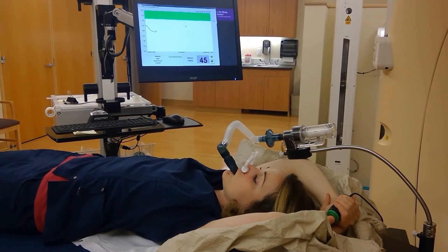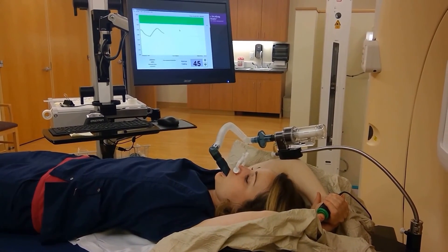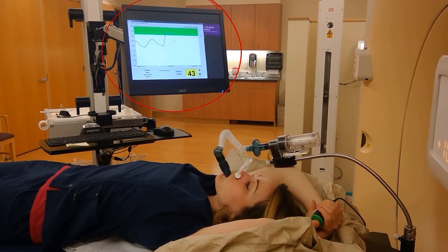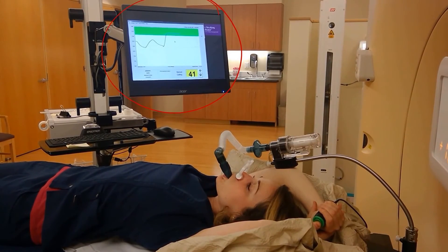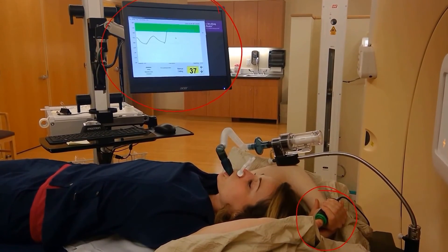This is an example of what it will look like during a breath hold. The patient pushes in her green button and takes a few normal breaths as you can see here on the computer screen. She then performs a breath hold where she hits threshold and is kept at the same lung volume. Once she releases the green button, she is able to breathe freely.